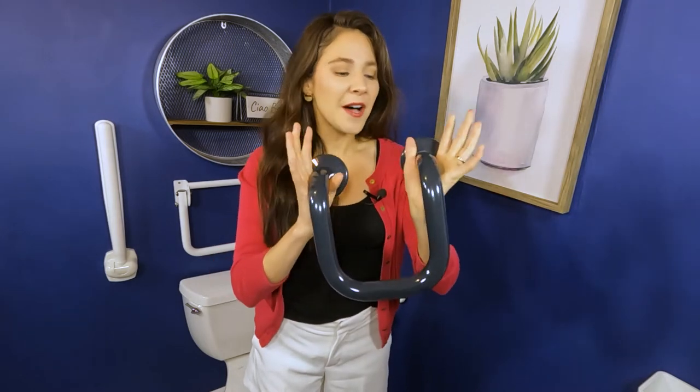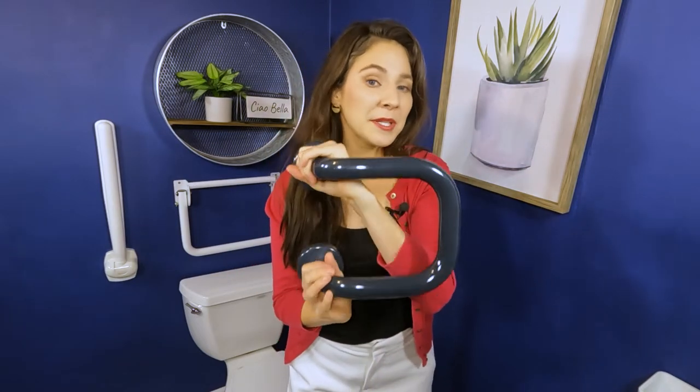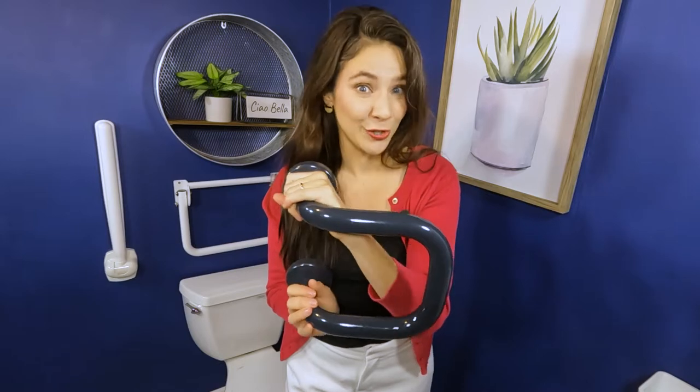Let me show it to you. This one is a vinyl-coated grab bar by Ponte Giulio. As you can see, it is U-shaped and it has this kind of sneakers-on-a-gym-floor feeling when you grip onto it. I would love for you to come along with me today — we're going to go to different parts of my house and see where we could put this grab bar to get the most use out of it.